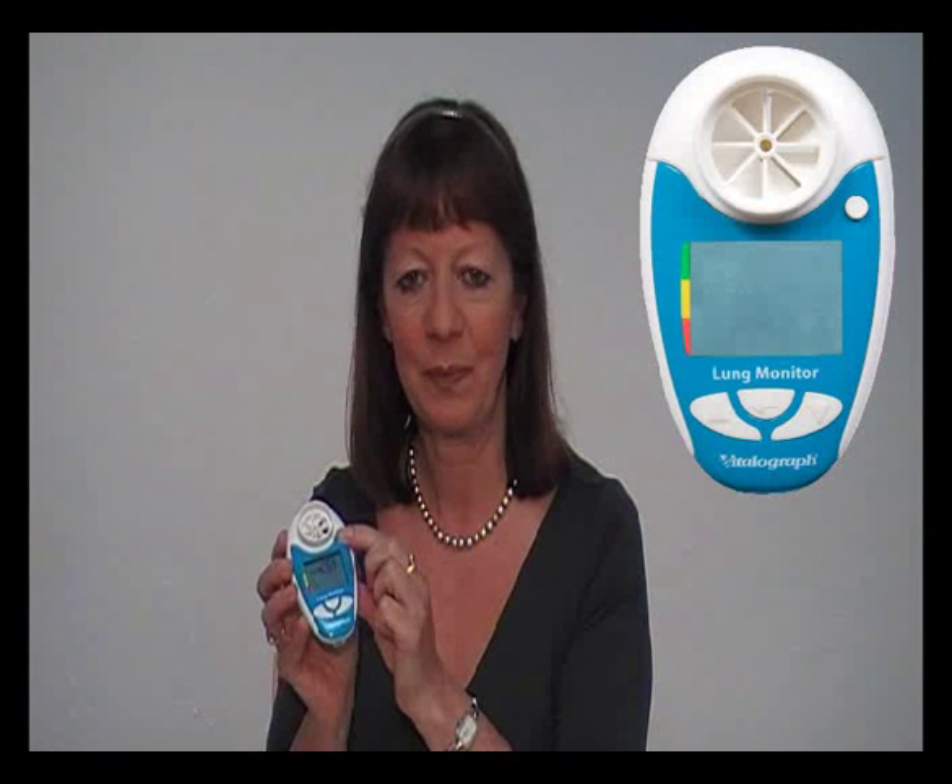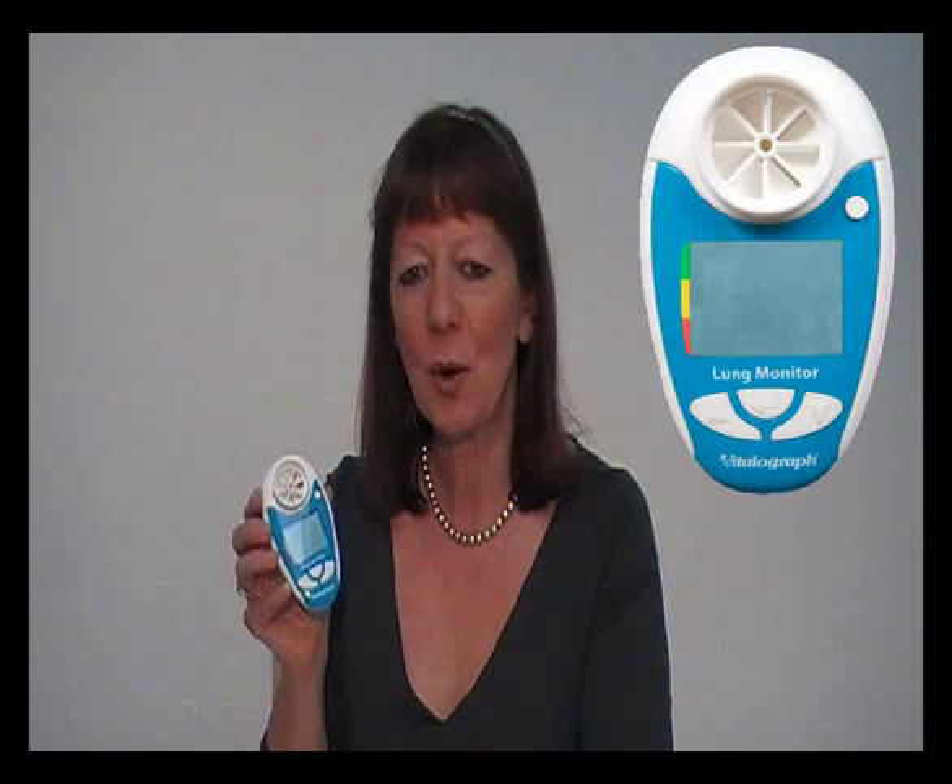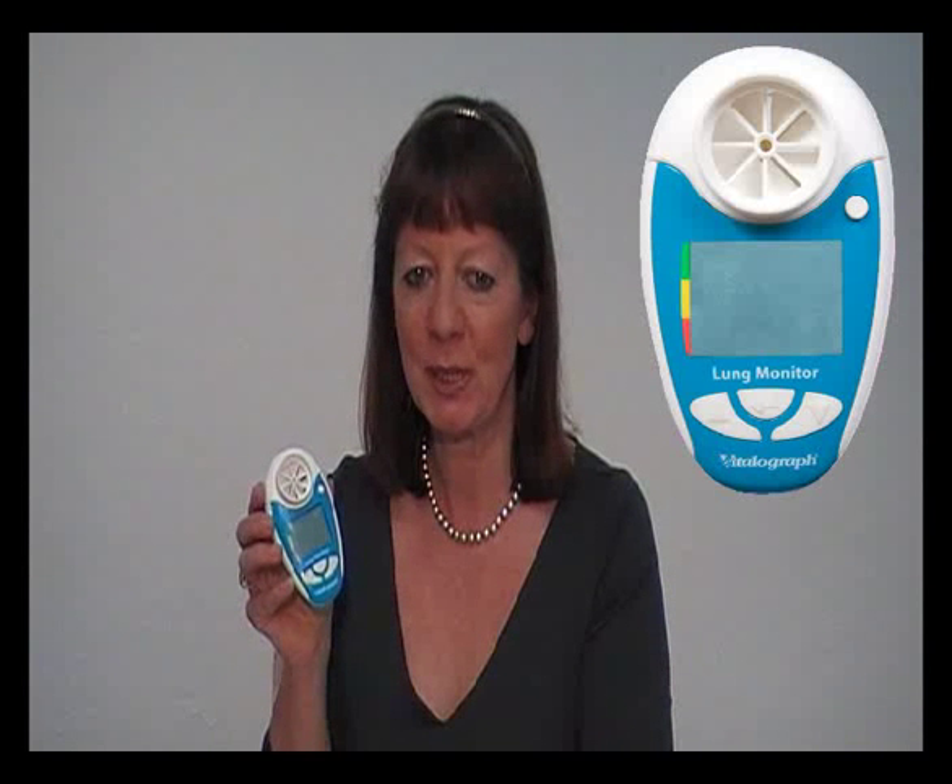Use the circular button to turn off the device. The Lung Monitor will automatically store the best values from the session and will store up to 200 test sessions.